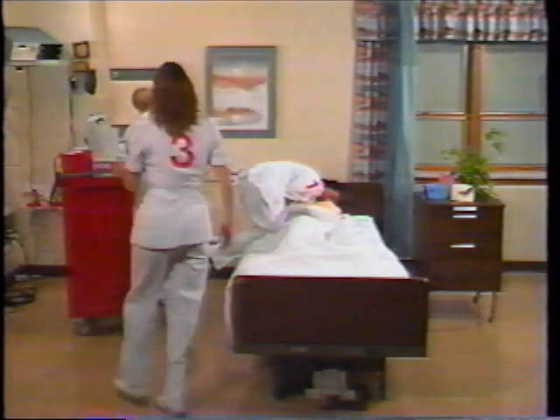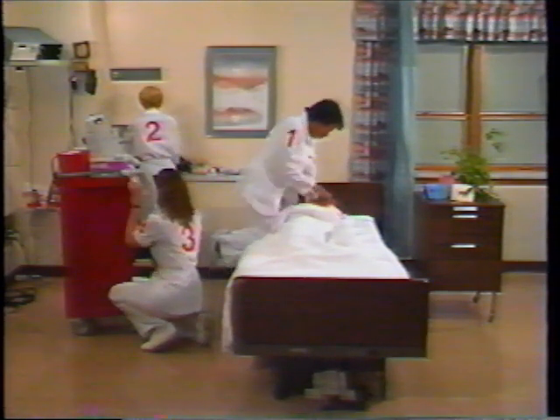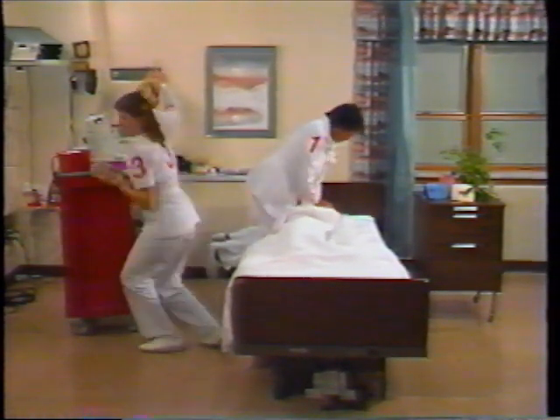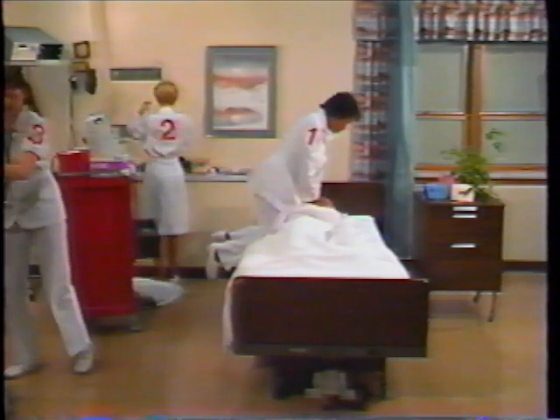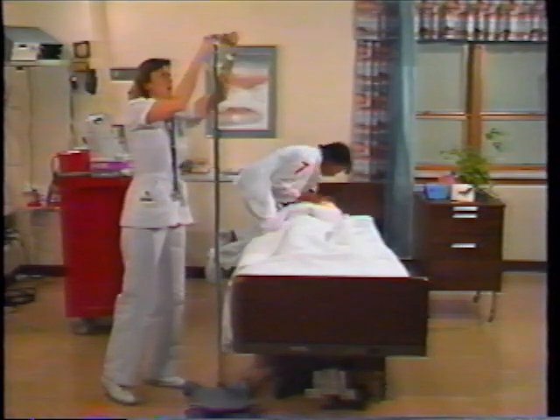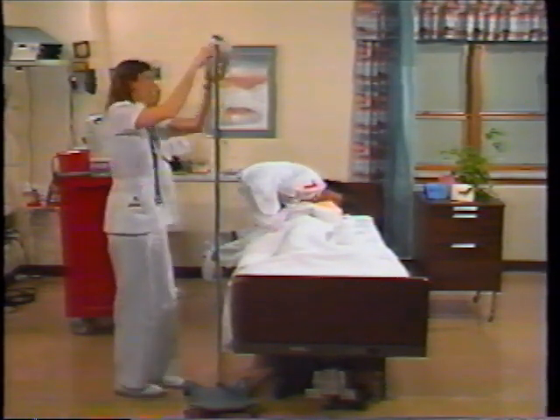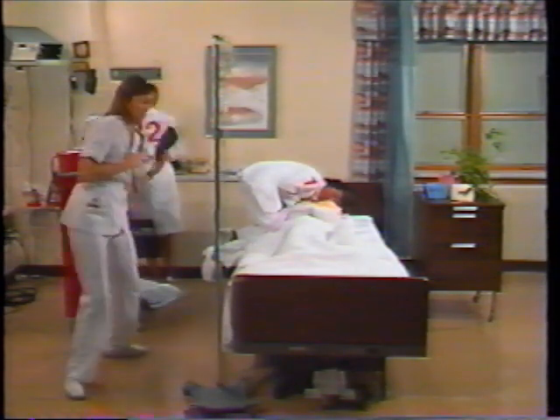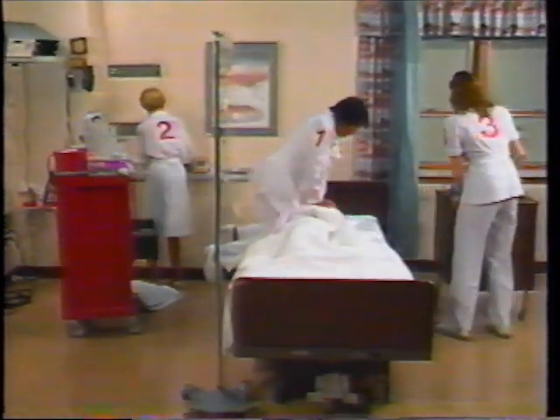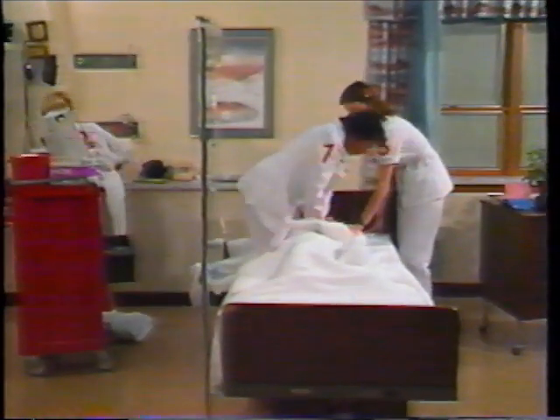What else do you need here? I'll need an ID. I could use some help. Can you start this ID? Sure. 1, 2, 3, 4, 5.